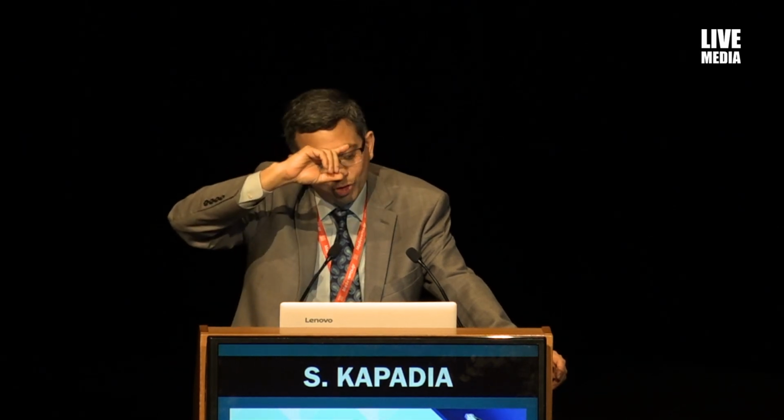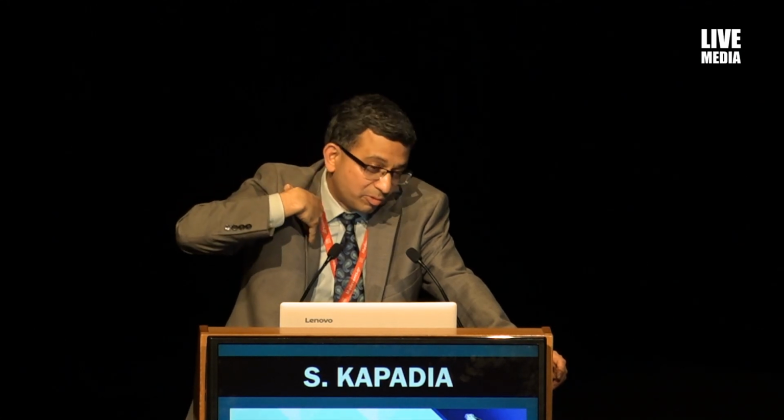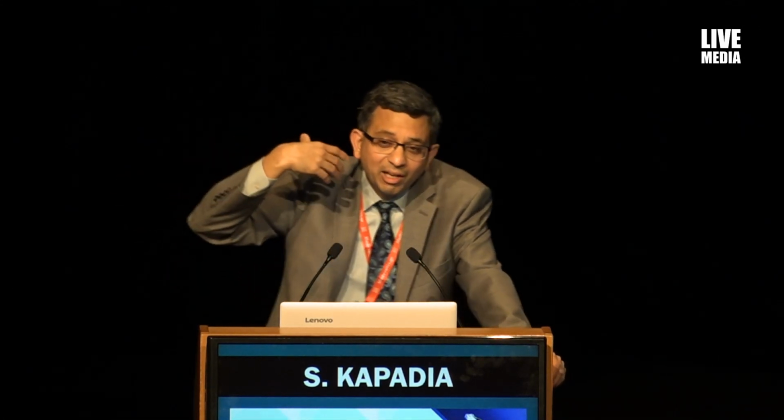I am less impressed by the AR because we cannot tolerate aortic regurgitation. Even 3-4% of aortic regurgitation was hurting us. I didn't show you the data for the last 5 years, but in our hands, which may not be the best, Evolut Pro was not available. There are a lot of new things that have happened, but this is the reason.